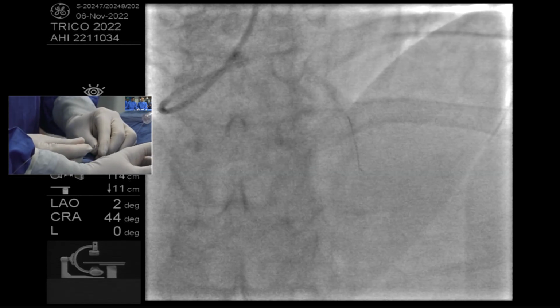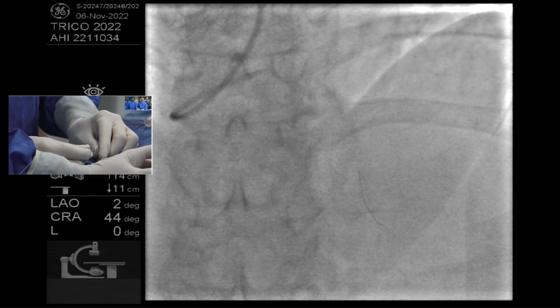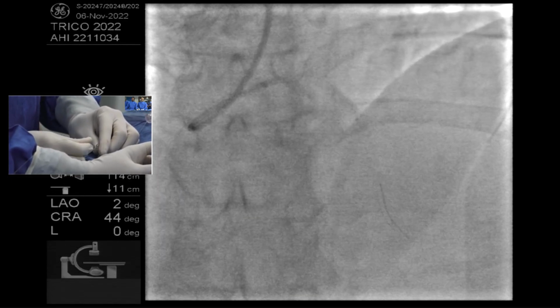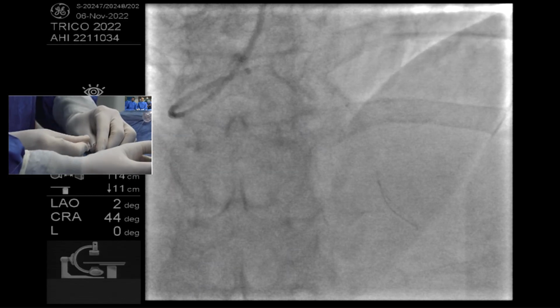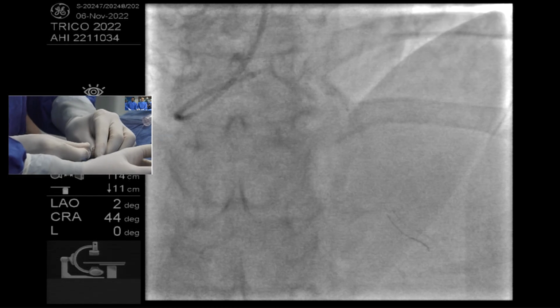Looks good. Little more. The tip is the key here, the small tip, very important. Here, if you are giving a secondary curve, you are in trouble. It'll trap everywhere. It's okay, Sanjay.